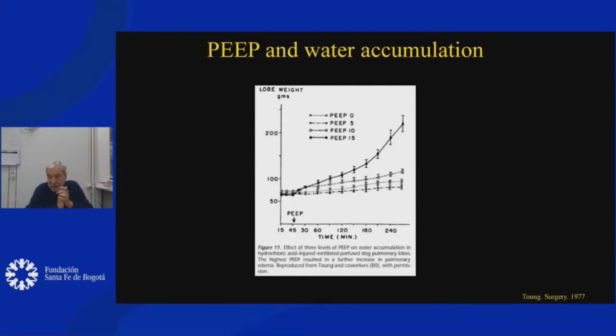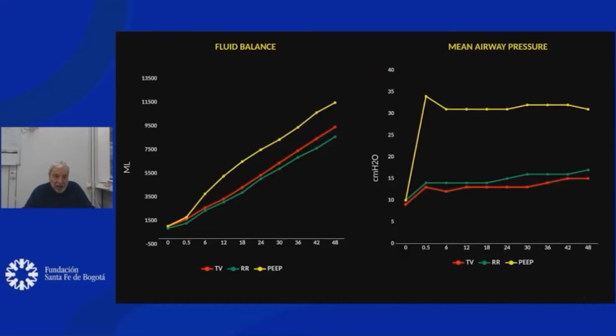So, my dear friends, when you touch the knobs of the ventilator and you increase the PEEP, remember that you are inducing not only a possible benefit on gas exchange, but a possible accumulation of water and damage in your patients. This is a study we did experimentally.